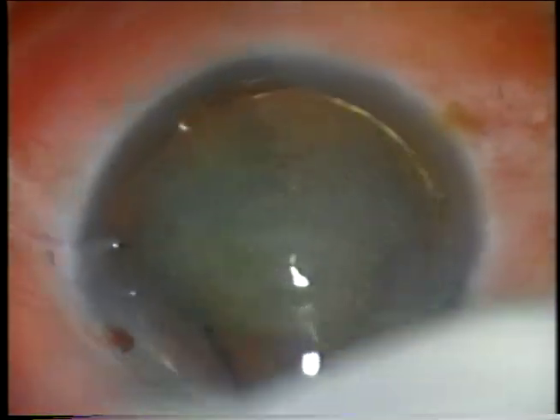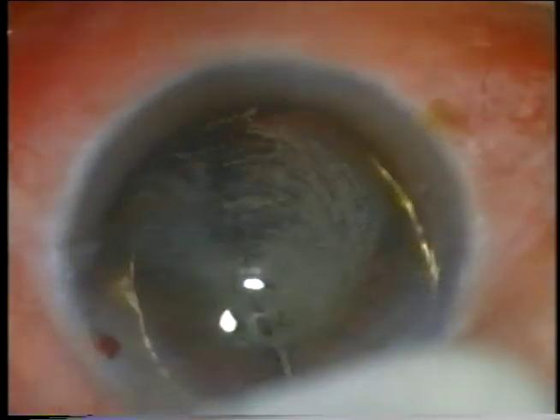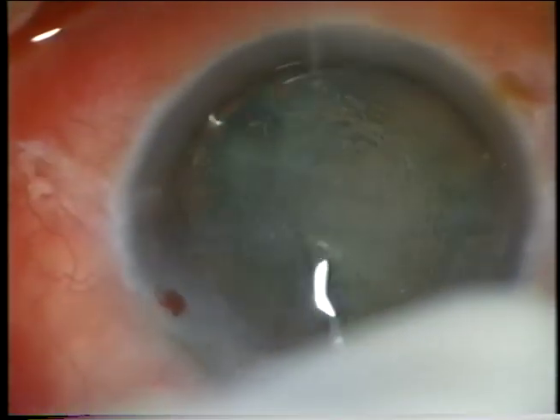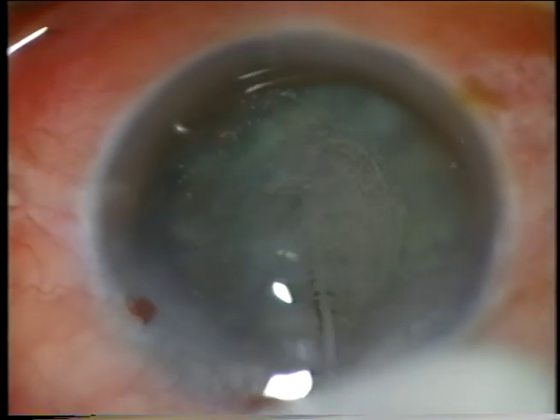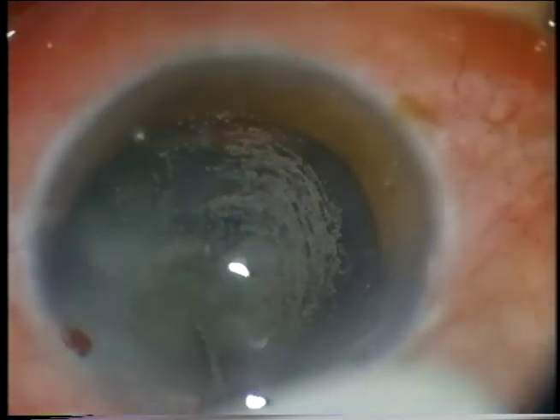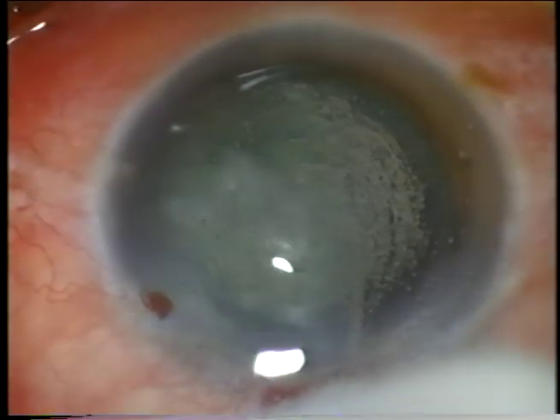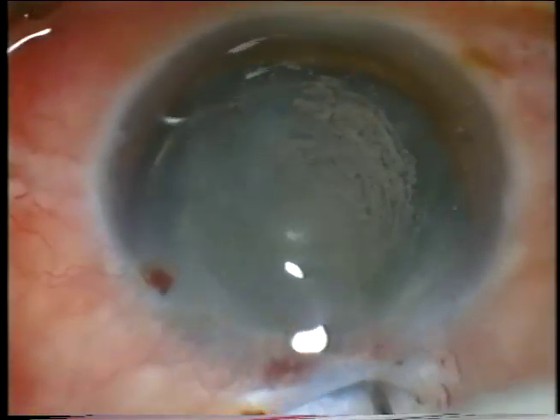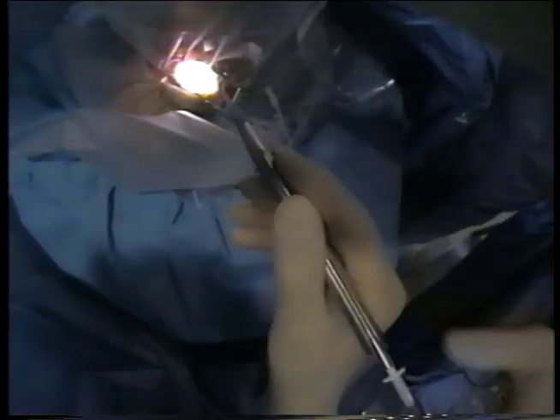Then I try to rotate the nucleus and even hopefully the epinucleus before starting phacoemulsification, because with my techniques I often rotate the nucleus for fracturing. I like to get the 12 o'clock epinucleus free while the nucleus is still attached to it, because the nucleus can help to rotate the epinucleus out of the 12 o'clock position.